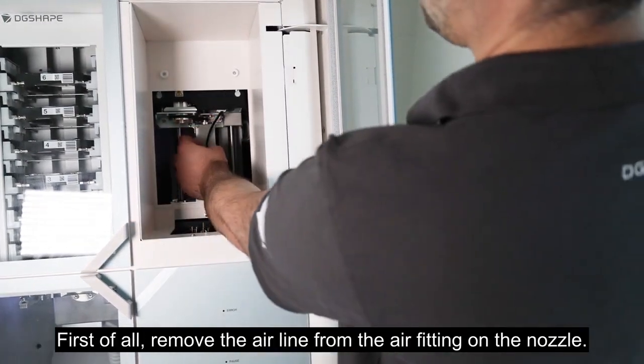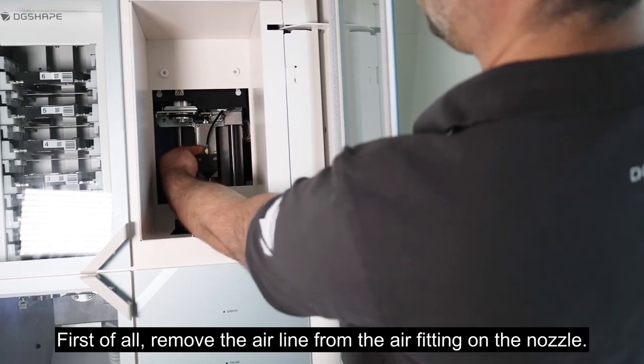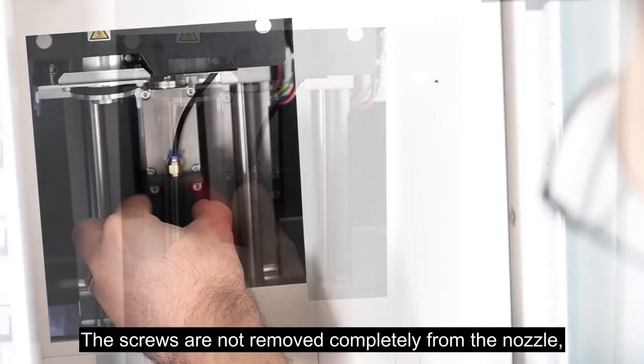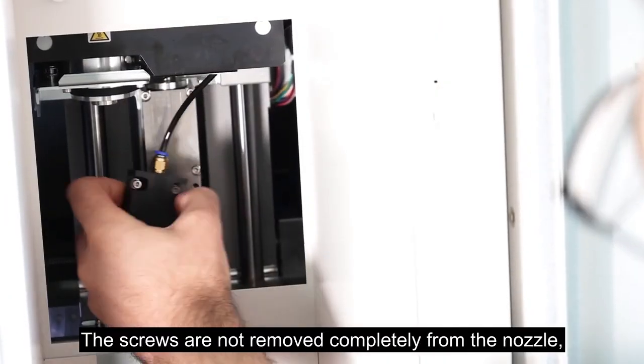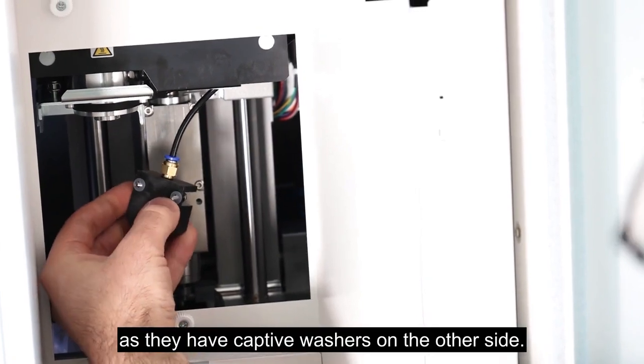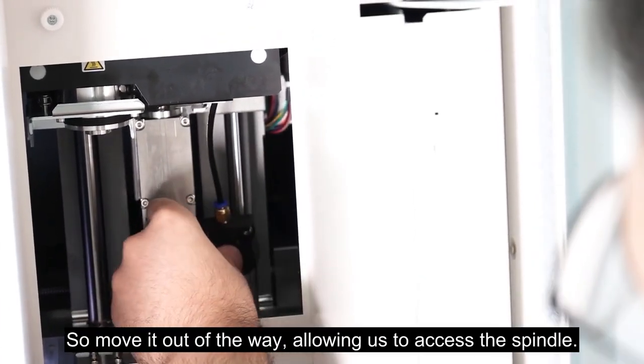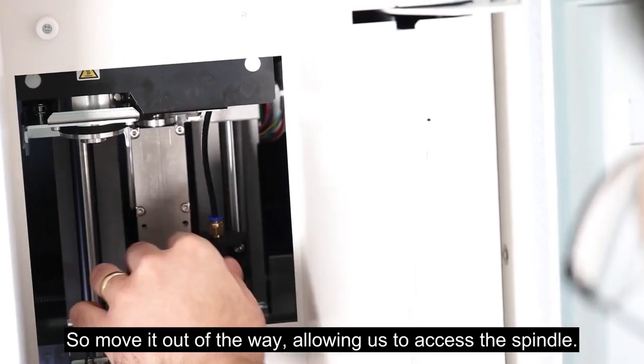First of all, remove the air line from the air fitting on the nozzle. Loosen the 2 screws on the air nozzle. The screws are not removed completely from the nozzle as they have captive washers on the other side. So move it out of the way, allowing us to access the spindle.